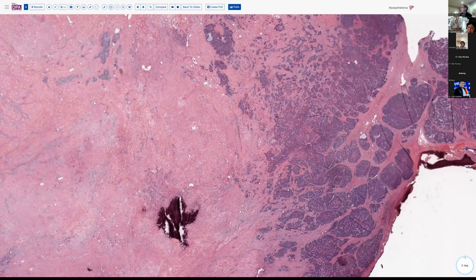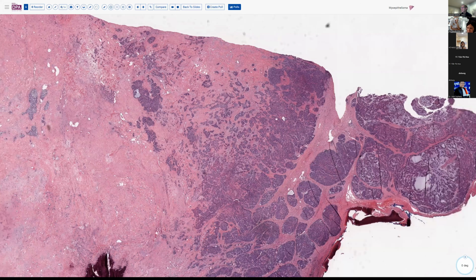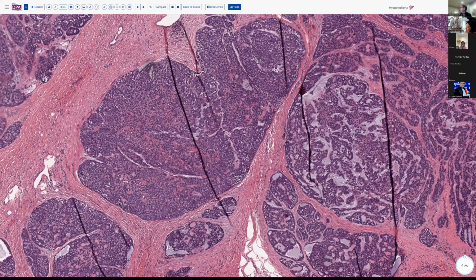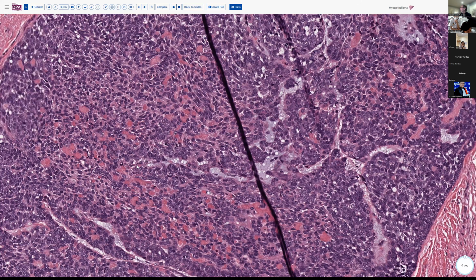I suspect that this is a lesion that had been long-standing, and then the patient noted a change in the lesion, which certainly could be an indication for considering the possibility of carcinoma from pleomorphic adenoma. But in the absence of otherwise clearly malignant features in this lesion, I think you could still classify this as myoepithelioma. You'll see here we don't have any high-grade atypia, didn't see any mitotic figures, and still relatively circumscribed.